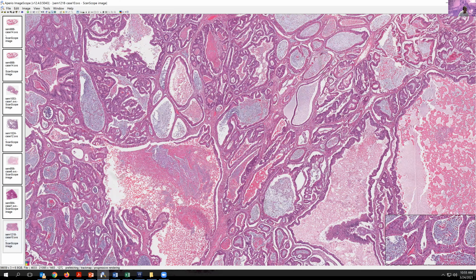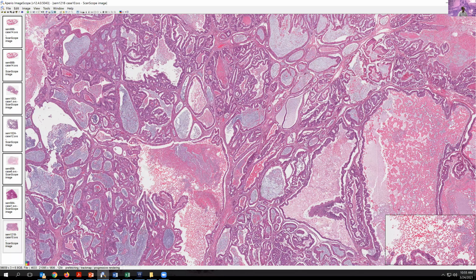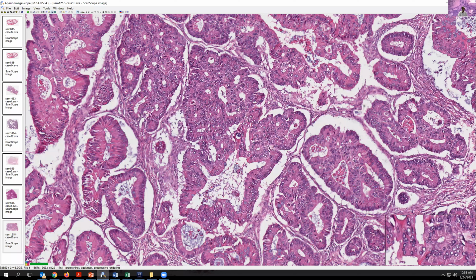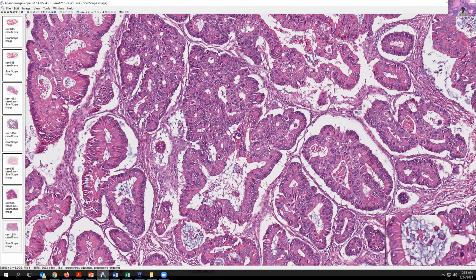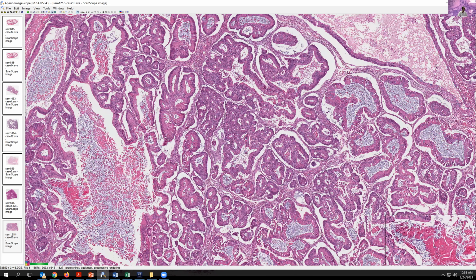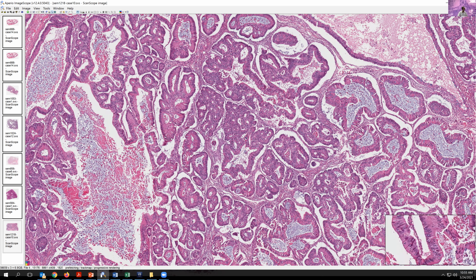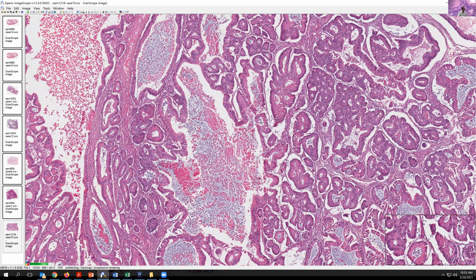Finally, we couldn't be showing metastases to the ovary without showing the sine qua non of these. This is the classic metastatic colorectal carcinoma, which we see here with these very tall cells and areas of busy, almost dirty necrosis in the background, especially here in these sorts of areas. So we speak of these tumors as having tall, dark cells with dirty necrosis. This is the catchphrase that's frequently used, but you can see that not every gland here has that pattern.